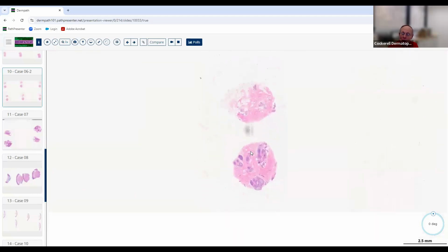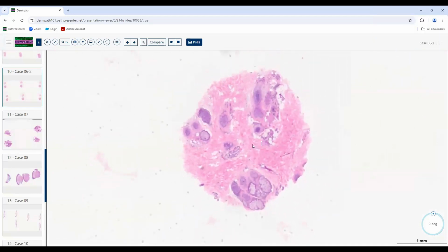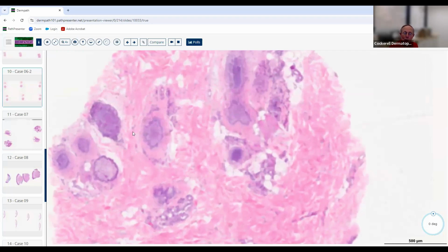Well, there's two ways the scarring develops in a hair follicle. Is characterizing the inflammatory infiltrate as either lymphocytic versus mixed enough? Well, that's an important finding also. You're correct about that. But there's two ways scarring occurs in an alopecia, if it is scarring alopecia. One, it can be kind of like a rifle shot, like a sniper. It can hit just the actual follicles. So it can be perifollicular, it can just hit the follicles themselves and leave everything between the follicles alone.